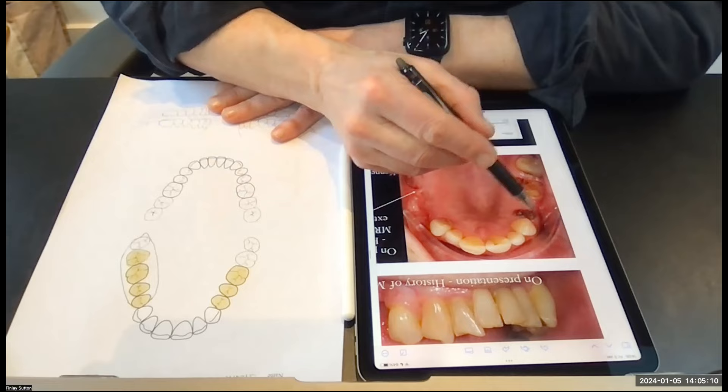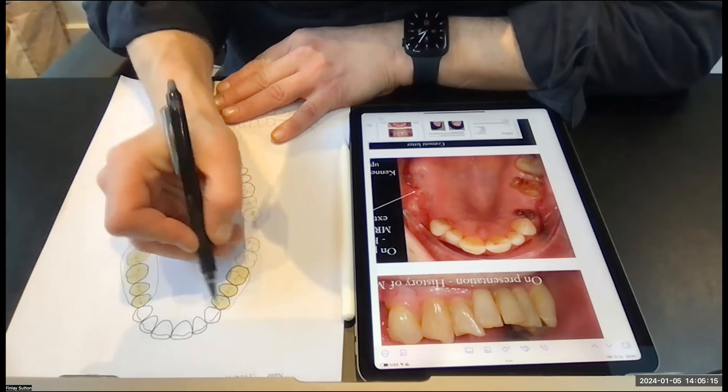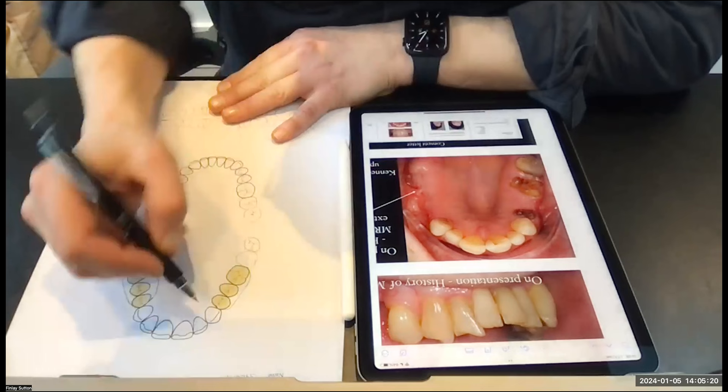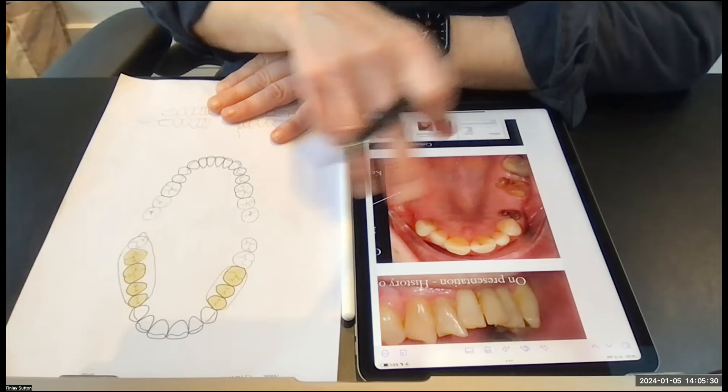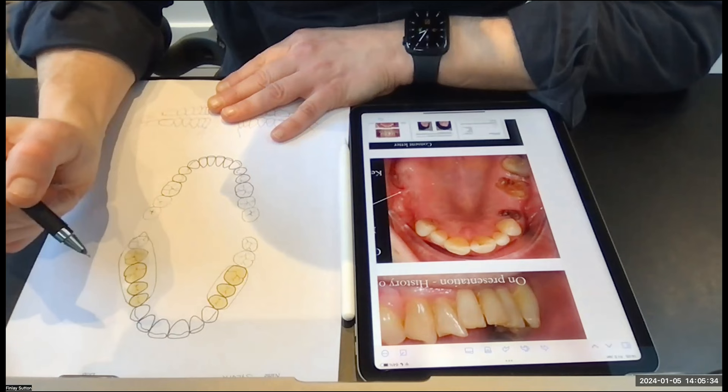This bit here is a saddle section, so I keep referring to my photographs and fill in that space there, keeping the pink away from that area. These roots are going to be retained — we're not going to take those out at all because she's prone to having MRONJ, this horrible necrosis that occurs when a patient has a tooth out.